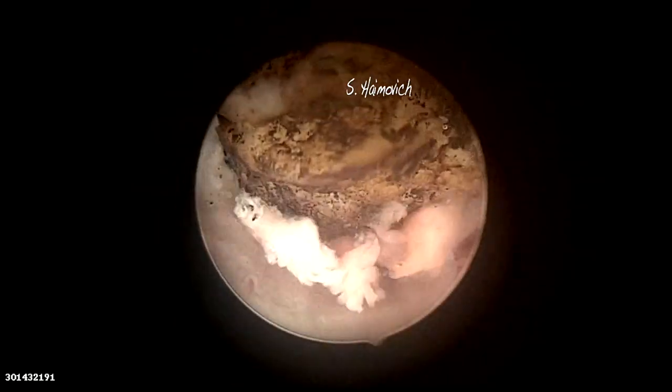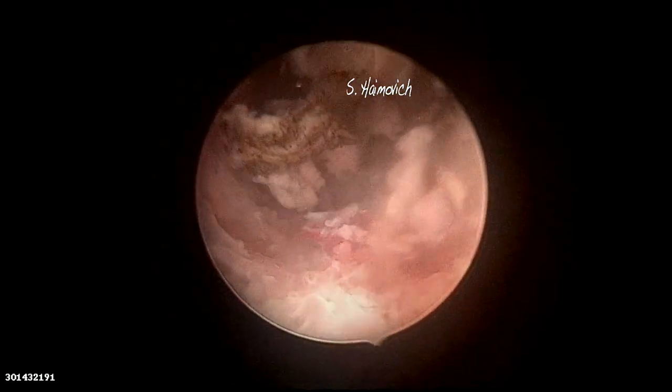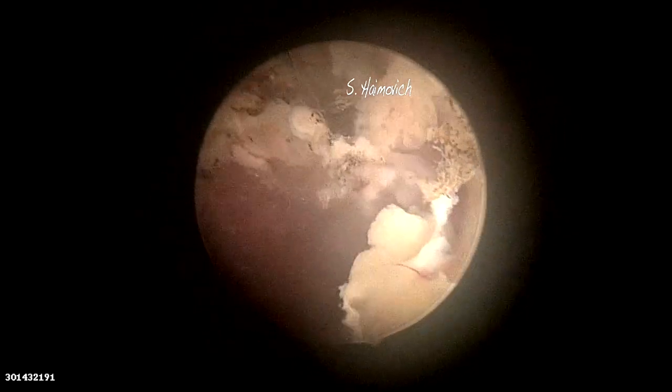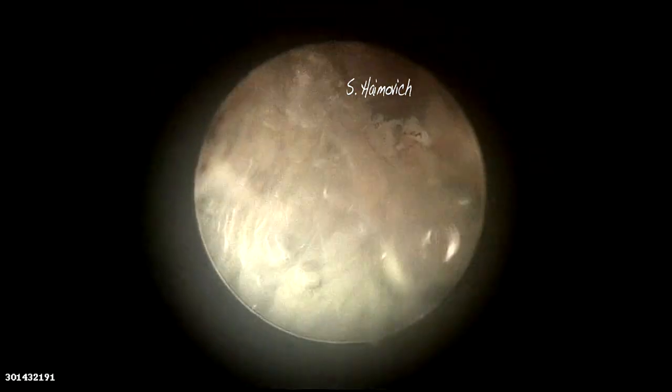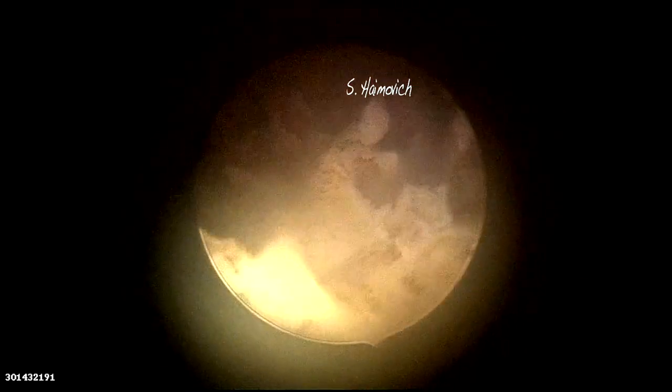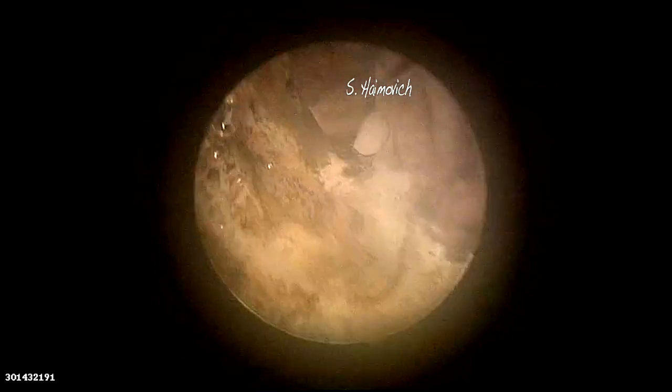After the removal of the fibrotic anterior arc, we proceed to perform an ablation of the inflammatory endometrium. As seen in the images, with the diode laser, ablation is also feasible with the same probe. The ablation has to cover 360 degrees of the isthmocele without leaving any inflammatory tissue.